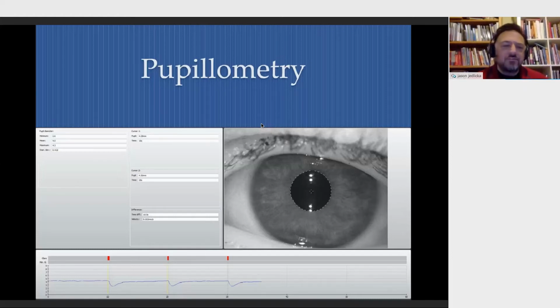And so this allows you to get an idea of pupil size in both bright and dim light. And when it comes time to multifocal contact lens design and deciding the parameters you want in that area, the pupillometry option is very helpful here too.